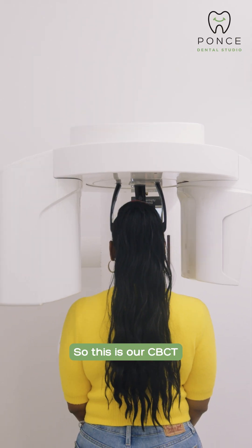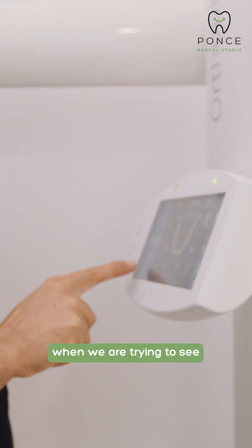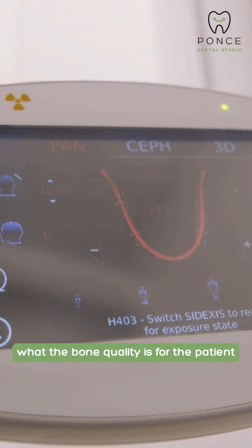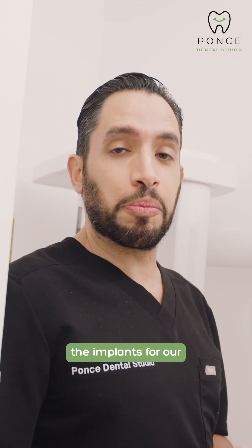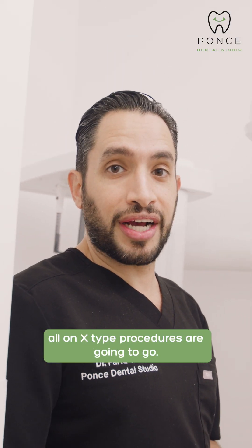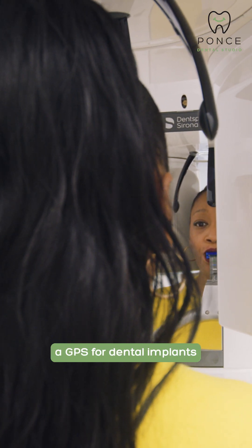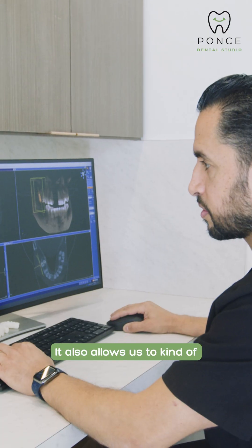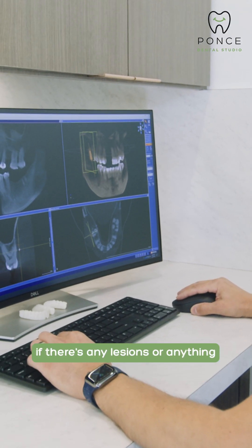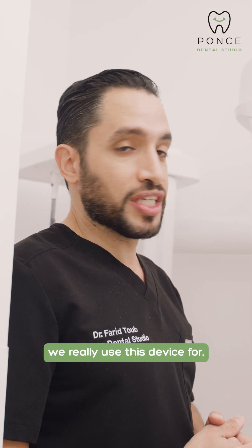So this is our CBCT, this is our cone beam scan. This is the equipment that we use when we are trying to see what the bone quality is for the patient and deciding on where the implants for our all on X type procedures are going to go. Think of this as basically a GPS for dental implants. It's going to tell us exactly where the implant needs to be placed. It also allows us to see your oral anatomy if there's any lesions or anything in the patient's mouth. That's what we really use this device for.